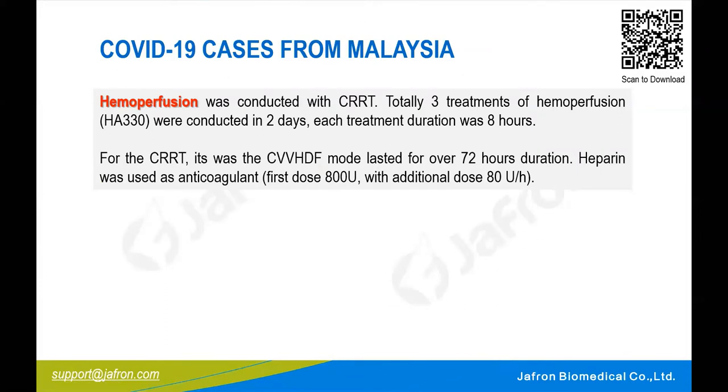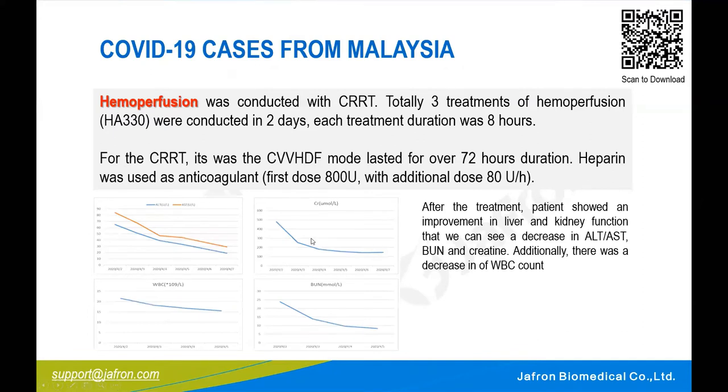This patient also received hemoperfusion combined with CRRT, totally three sessions of hemoperfusion combined with CRRT, conducted over 2 days, and each duration was 8 hours. For the CRRT, it was CVVHDF mode, and it lasted for over 72 hours. They used heparin as the anticoagulant. And this shows the improvement of the patient.